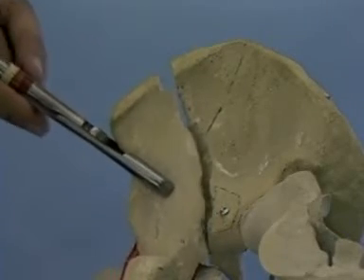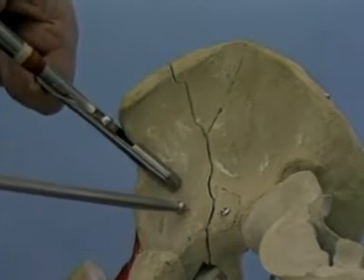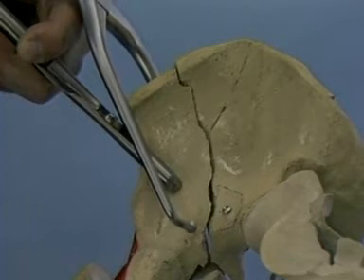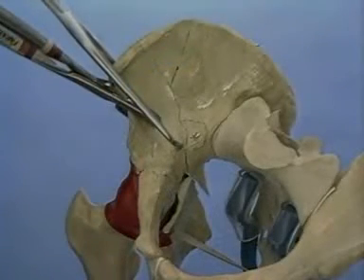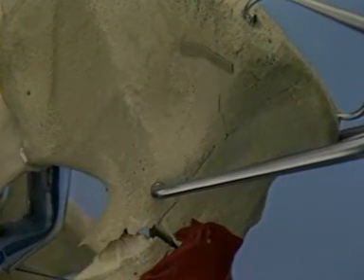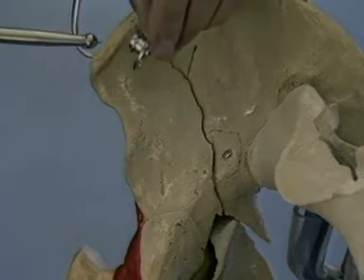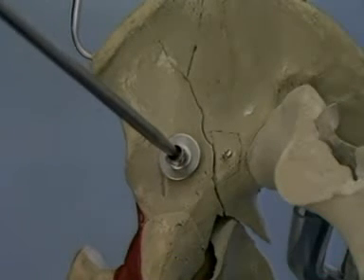A Farabeuf clamp is used to grasp the anterior border of the bone at the level of the anterior inferior iliac spine. This clamp will control the rotation of the anterior column. Pressure with the ball spike near the pelvic brim corrects the medial displacement of the anterior column. It's often helpful to place the king tongue on the inner and outer aspect of the bone to complete or hold the reduction. Pointed reduction forceps are used along the iliac crest. The two points are positioned on different bone fragments because of the obliquity of the plane of the anterior column fracture. A spiked disc can be attached to the tip of the ball spike or other ball-tipped pelvic reduction instruments to prevent penetration in osteoporotic bone.